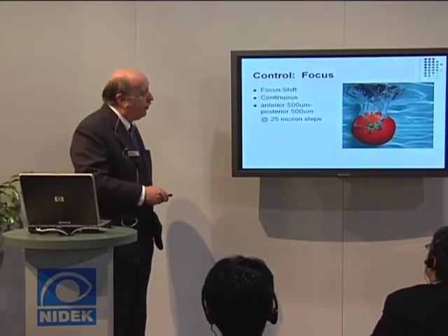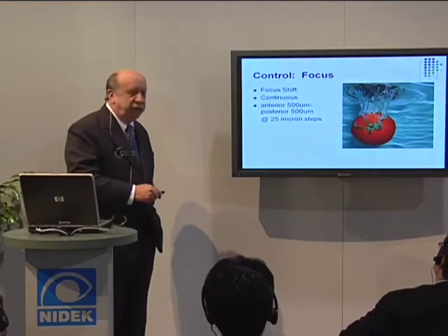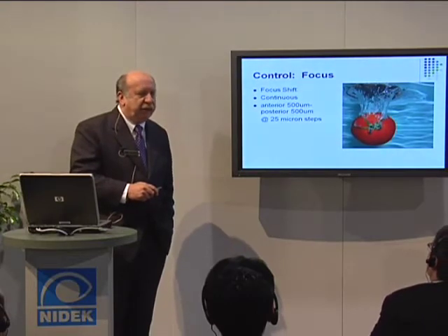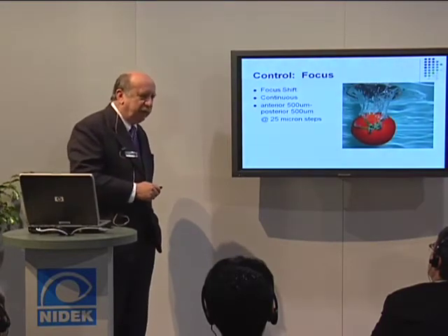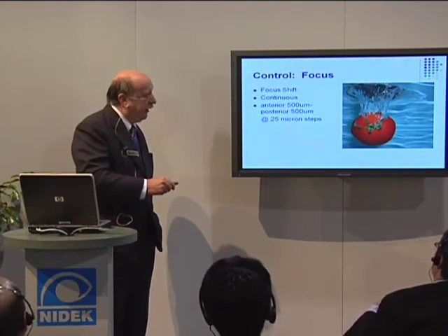So this is an animation of a capsulotomy. It was sent to me by a doctor. He said this is what's really happening with a capsulotomy. We know that the YAG laser doesn't actually cut the tissue. It makes a sound wave or a shock wave that cuts the tissue. So this shock wave here will come back and actually cut the tissue here.